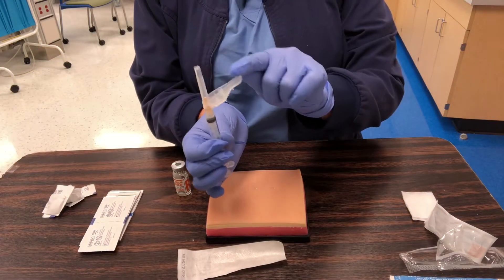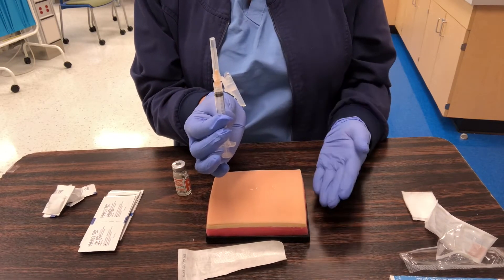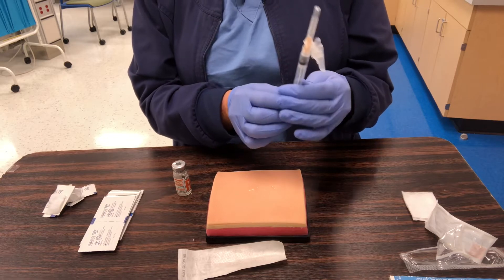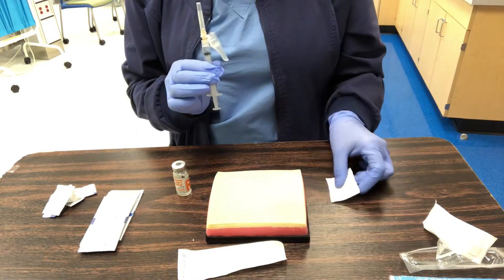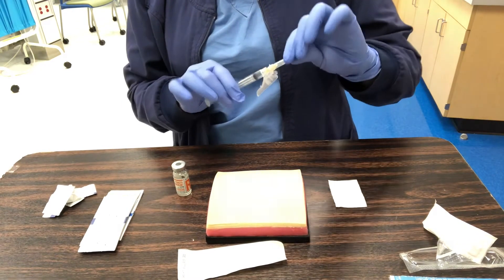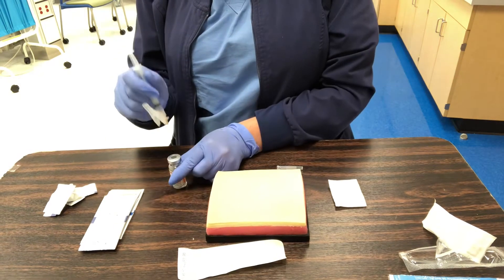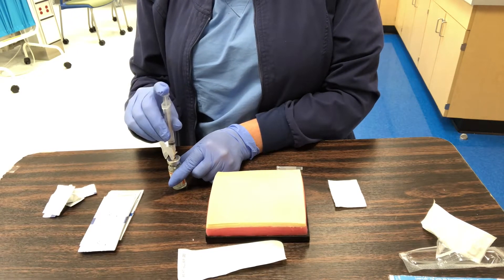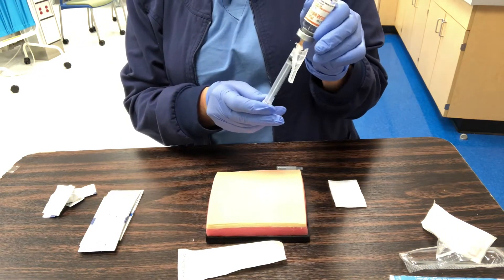This needle has a safety — when you pull it back it leans all the way back, and when done I'll engage it to protect the patient and myself. I'm going to give half a milliliter of medicine — that is the calculated correct dose. I have my vial ready and my gauze. I'll pull off the cap, set it on the table, inject into the center of the vial stopper, and push my air in. Note: never touch the inside of the plunger, as it needs to remain clean.